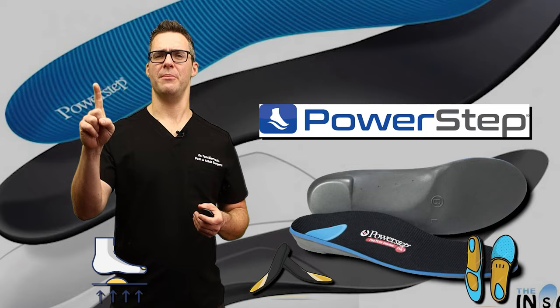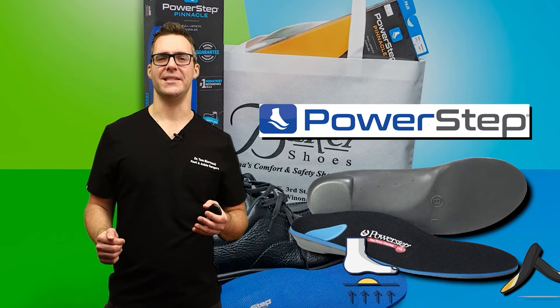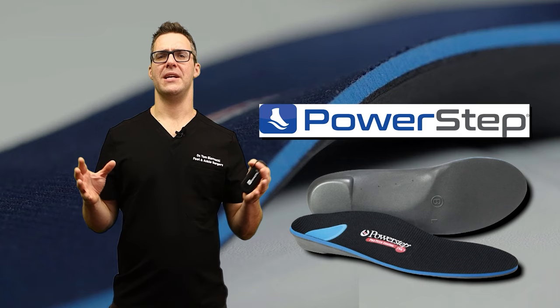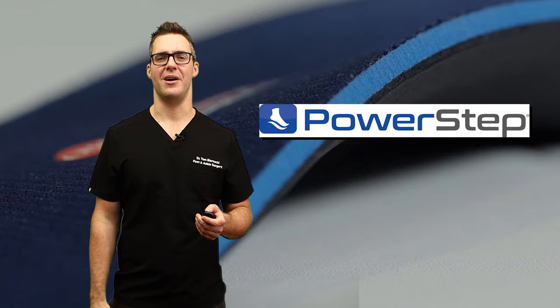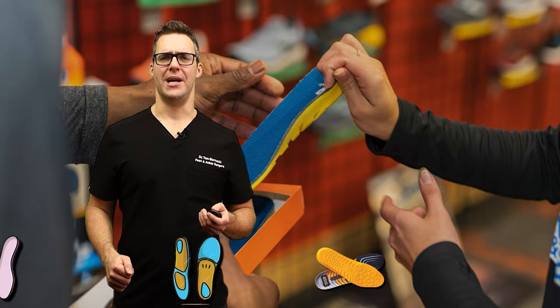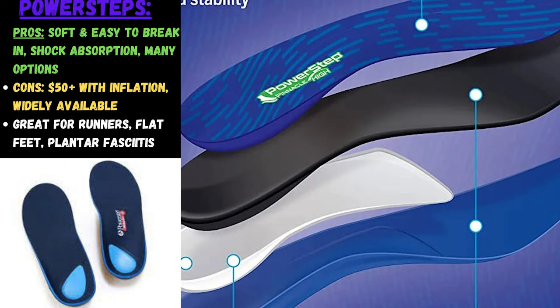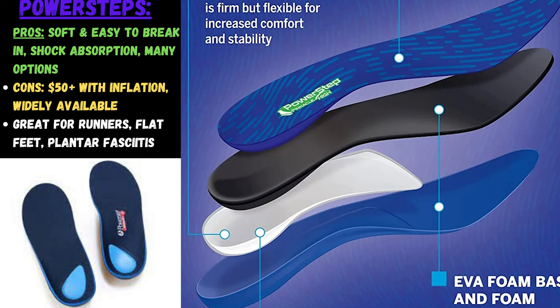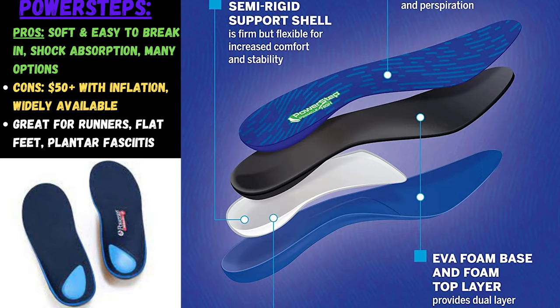PowerStep was started by a podiatrist and is probably the number one seller of higher quality orthotics. They have many different brands — more aggressive ones and less aggressive ones. On a scale of one to ten, they're probably a four or five on the correction matrix: pretty soft but giving you some support. I recommend the full-length or half-length one. They're widely available, and I can't go wrong with PowerStep. The price has gone up with inflation, but it's a good choice — better than Dr. Scholl's for the fit, athletic, and durable person.